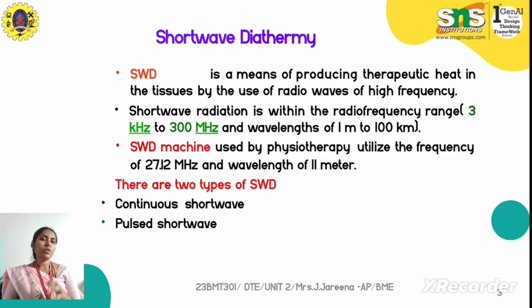The reason for using shortwave radiation is that, when you compare to other electromagnetic radiation, shortwave radiations have very good penetration power. We also have different bands like longer bands, middle bands, and a short wave. The reason to choose the short wave is that the other two bands will induce muscle excitation and create unwanted effects.